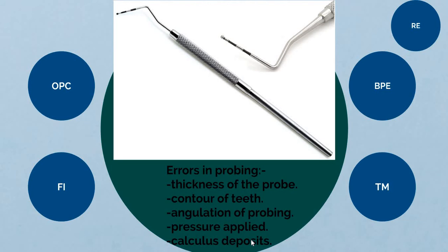But when you have a strong periodontal ligament attachment to the root surface and a good periodontium, you see that there's a difficulty of penetrating the gingiva. Probing depth measurement is influenced by these factors that we talked about.